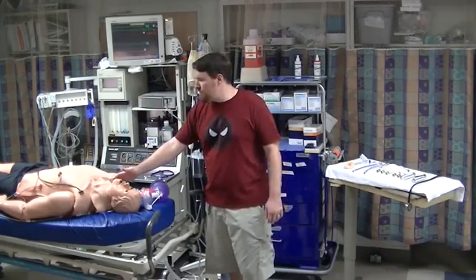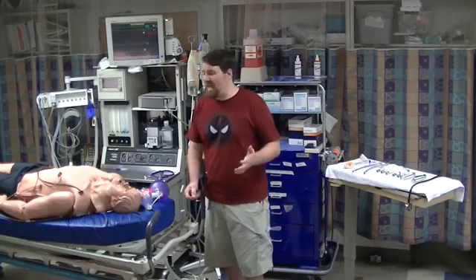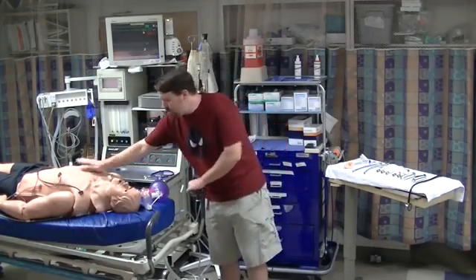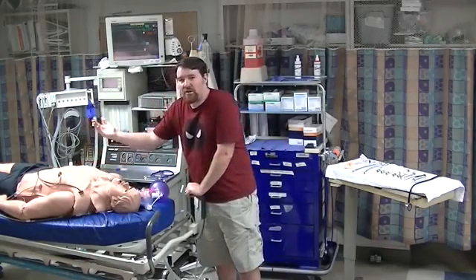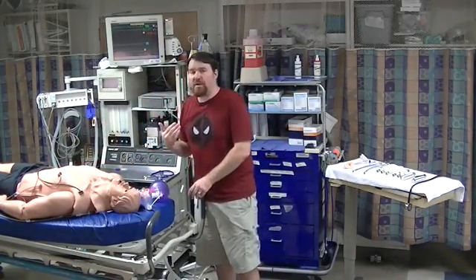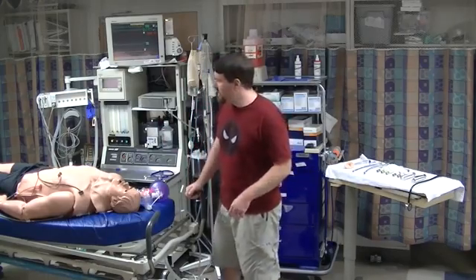To examine this gentleman, the first thing you need to do is your ABCs: Airway, Breathing, Circulation. The easiest way to assess for airway is just to ask him his name — sir, can you tell me your name? He's not talking to me. That lets me know that his airway could be compromised. Next is breathing, which we assess with a stethoscope to hear how his lungs sound.